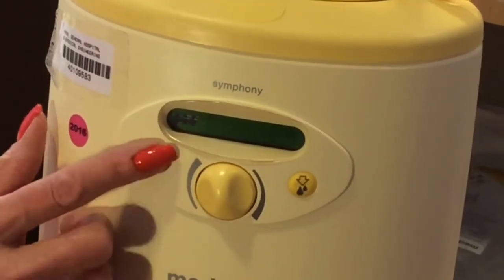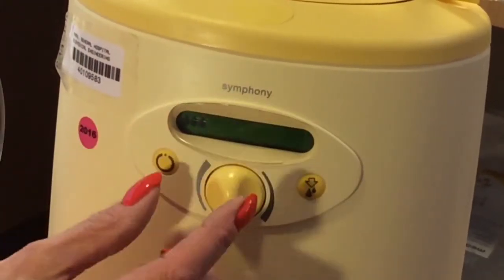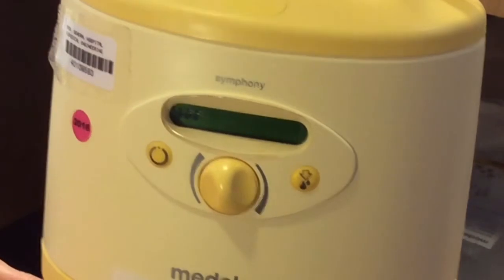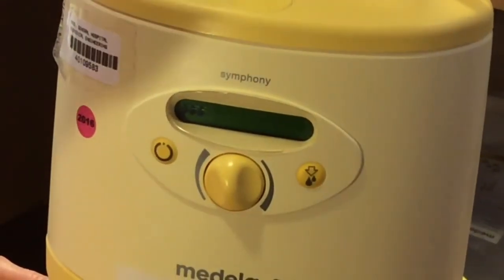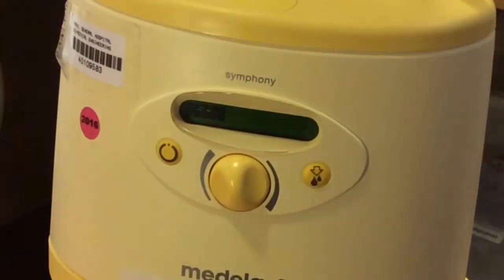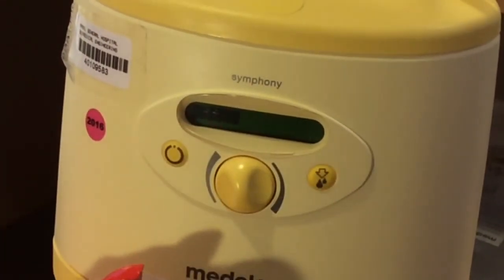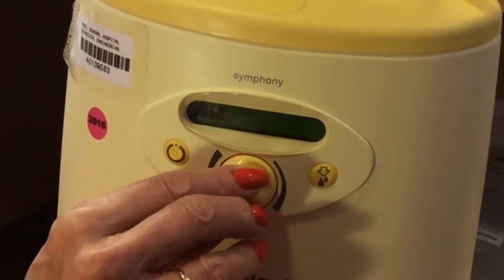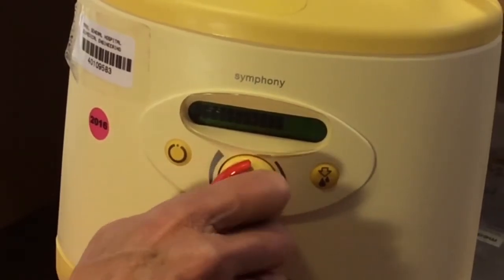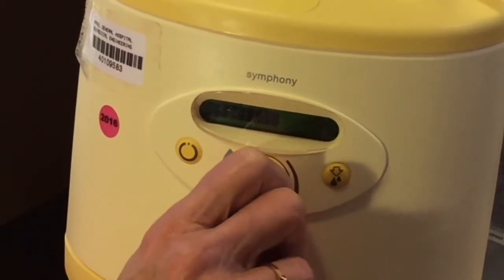For the maintain program, you just push this button and it will go into the maintain program. There are prompts that tell you what program you're in. It starts at three levels of suction in a stimulation phase that lasts two minutes. After two minutes, it goes to the stronger extraction phase and it will go up to three bars of suction. If that's painful, the mom should turn it down to comfort. If it's not painful, she needs to turn it to the point at which it hurts and then back to comfort. Always make sure she understands it should be comfortable, not painful.